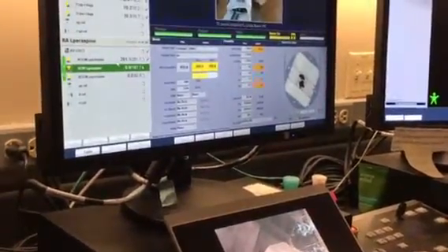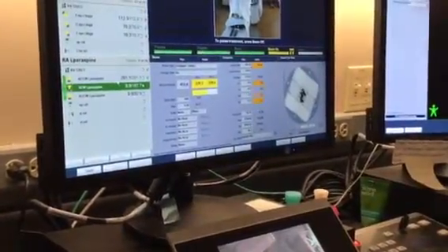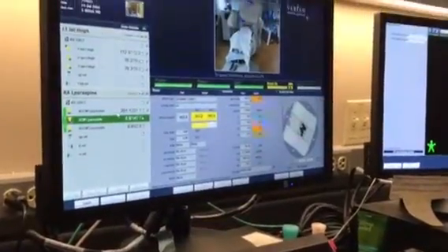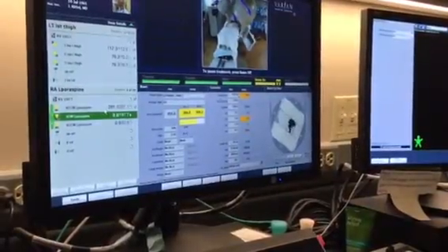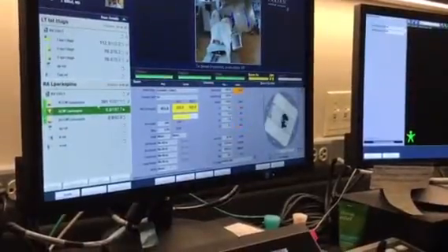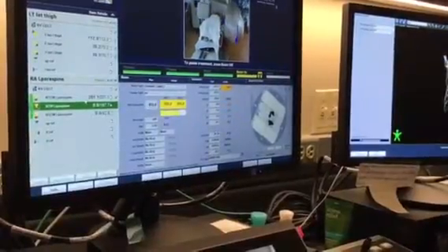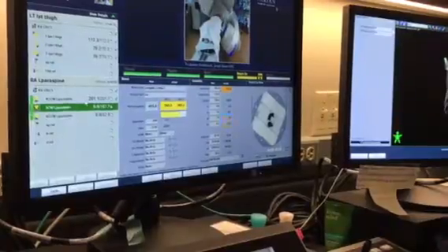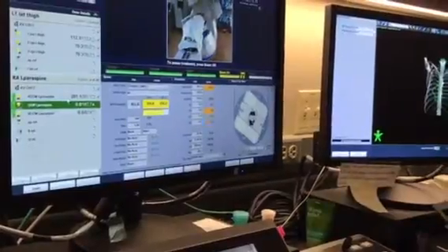Those leaves, he probably won't notice any, just a little bit of redness on his skin for this part of his treatment. Because it is rotating all the way around, the amount of dose going to each part of his body is very minimal. It's cumulative, the dose of radiation on his spine is much less than it is on his leg. On his thigh he's getting a dose of 200 centigray a day, whereas on his back it's 180 centigray a day. So it's just 20 centigray different, a little less.